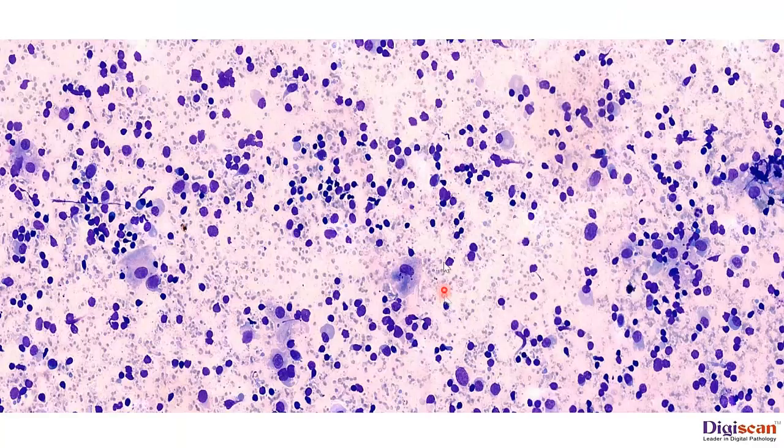Here you can notice that the patient has enlarged cervical lymph nodes. We performed an FNAC again at our laboratory since it was persistent. On low power magnification of the smears, we see a reactive lymphoid population showing various small lymphocytes as well as slightly larger lymphoid cells. And what is striking in the smear was that there were numerous histiocytes, which are these larger cells with the pale cytoplasm and the round to oval bland nucleus.